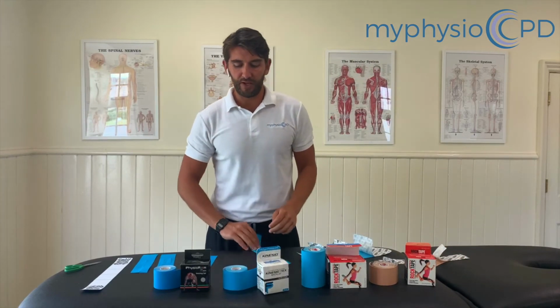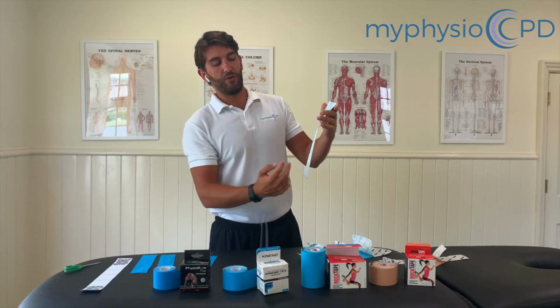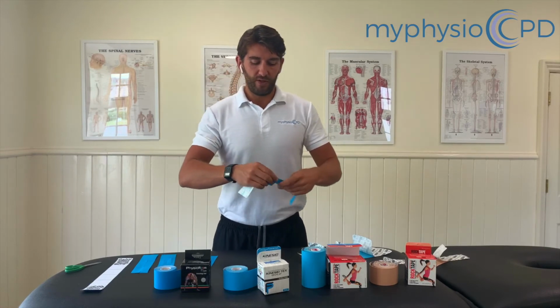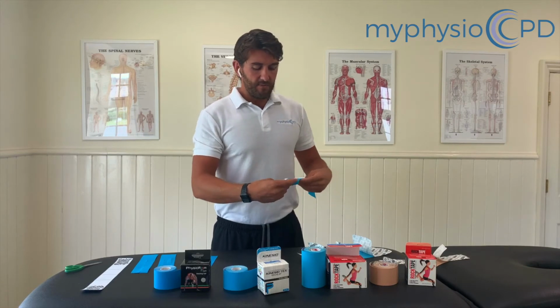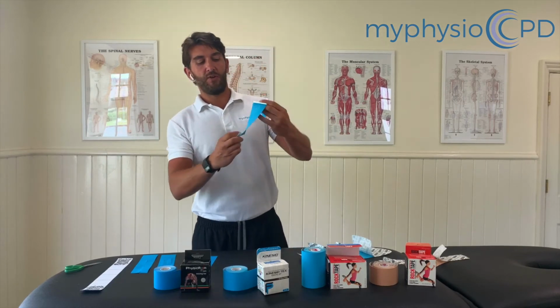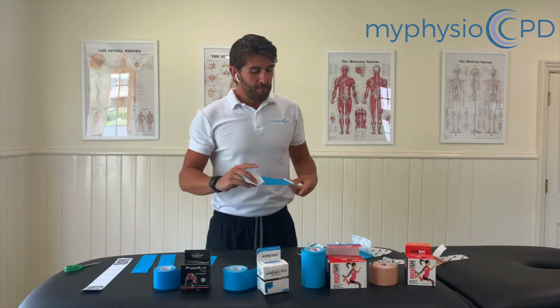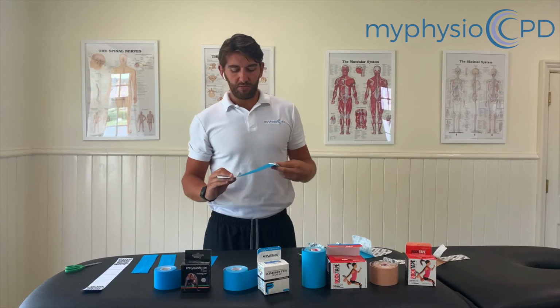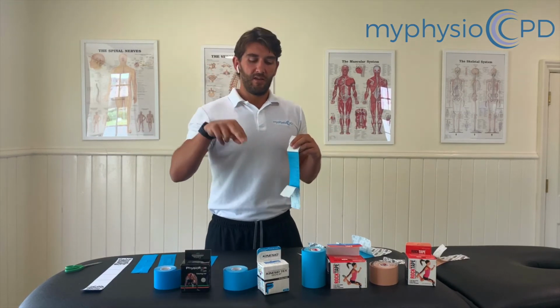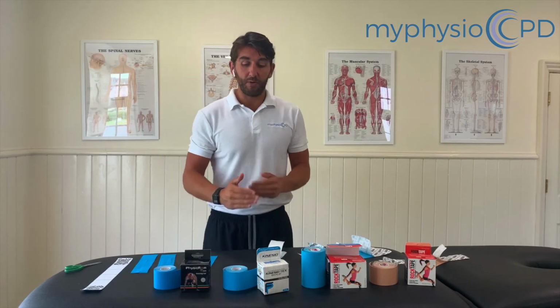So if we move on to the fingerprint technology, on the back there, we've got the horizontal markings and the longitudinal in case you want to divide it up into fan taping or edema control taping. So with this, if we tear it apart, it's not quite as robust and well made, in my opinion, as the Rock Tape. It's got plenty of stretch on it. This is the amazing fingerprint technology that's being sold. I'm not quite sure why we want fingerprints. And it looks pretty similar to the Rock Tape, to be honest. The etchings in the back of the tape are meant to aid lymph drainage as per the presentation there. So, yeah, not a bad bit of tape, but very expensive.